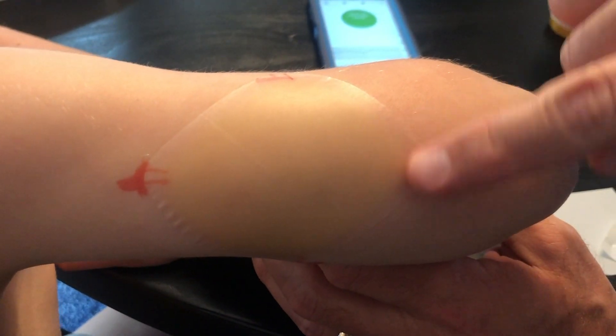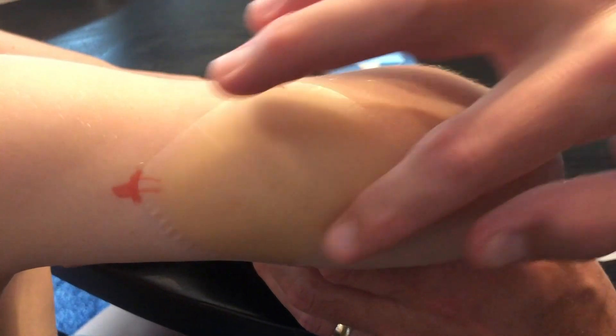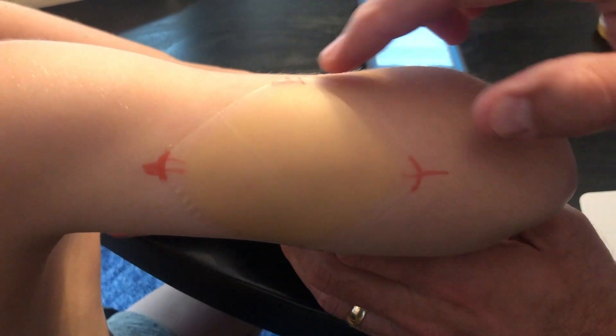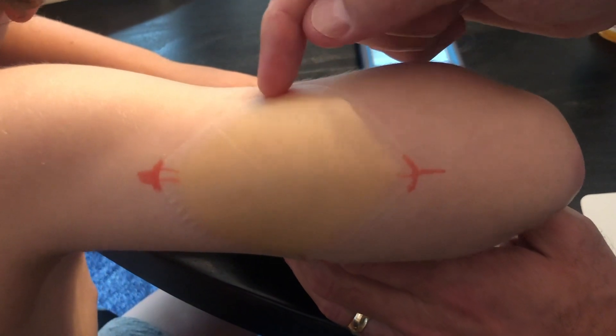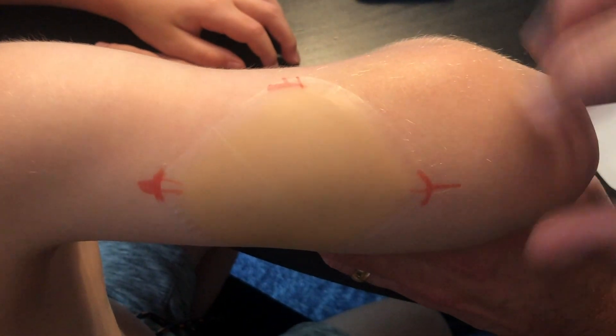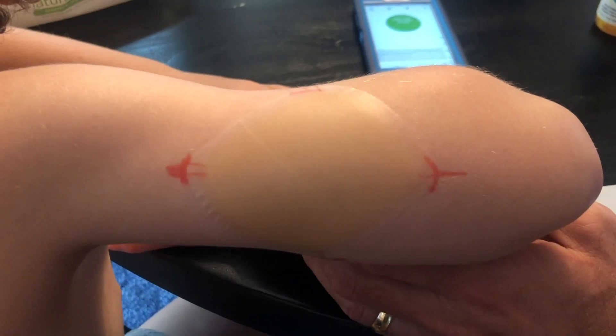Now that the bandage is placed, I've held it down to the arm for one minute while it dries, which gives it a better adhesion. The reason I heated it with the hairdryer is these corners will sometimes pop up — particularly on the sides — if it's not warm and soft. That's why we use the hairdryer.